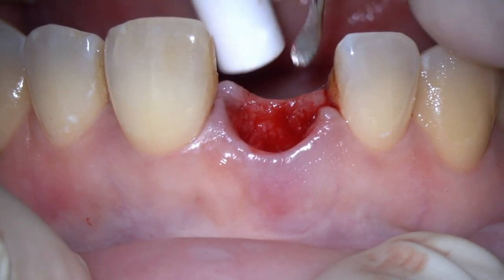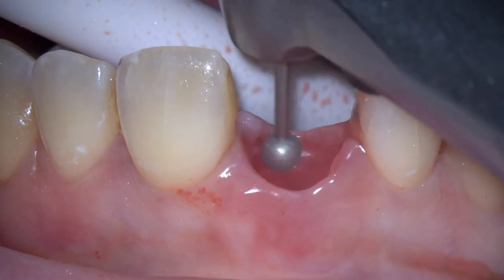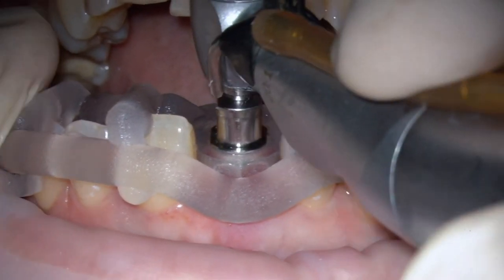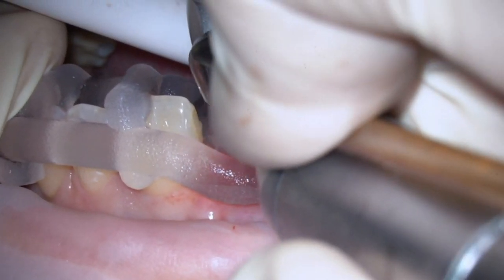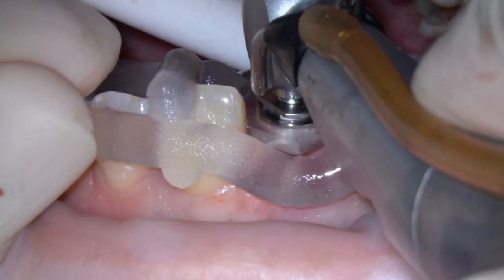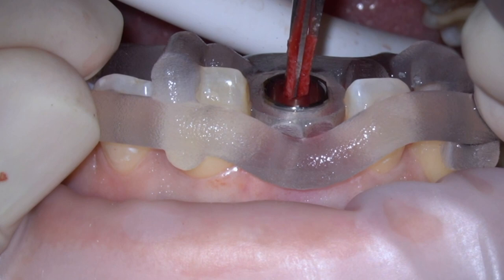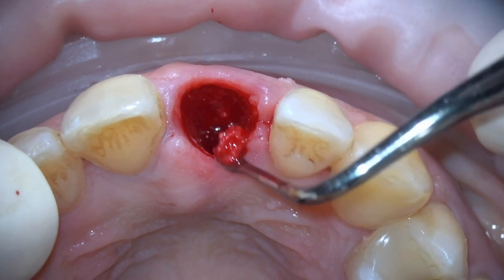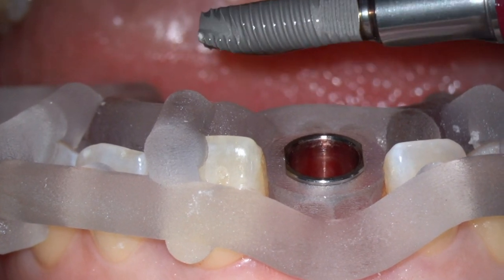Something I believe is important: we need to remove the sulcular epithelium and pocket epithelium if we have a pocket, and refresh the surface so we have a bleeding connective tissue surface. The drill sequence is typical for the M guide — we start with the pilot drill, then the yellow one and the red one. To ensure primary stability I'm not going to use the final drill at full depth. We're in a good position here, parallel to the initial root socket, so we have enough bone to engage.